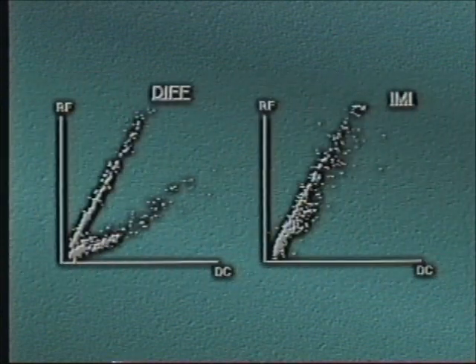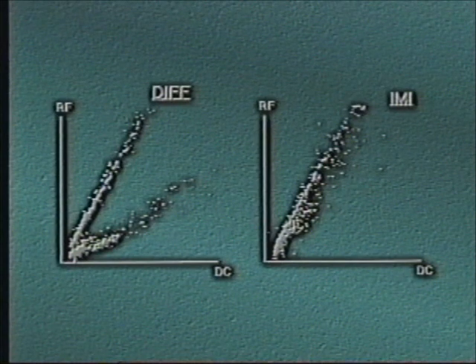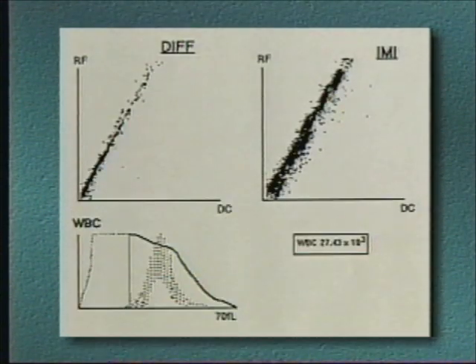The scatter plot, which is not as helpful but should be viewed, does not show increased thickening of this line. Since red blood cell and platelet technology is the same on these instruments, there is no need to continue to show these parameters. This is an example of an unacceptable result on this instrument.